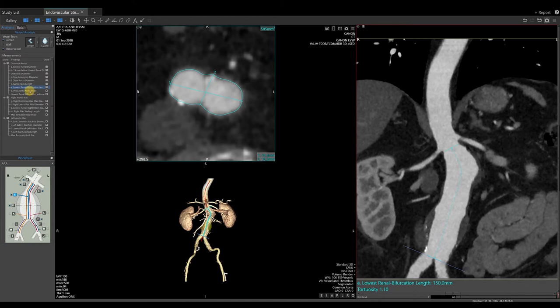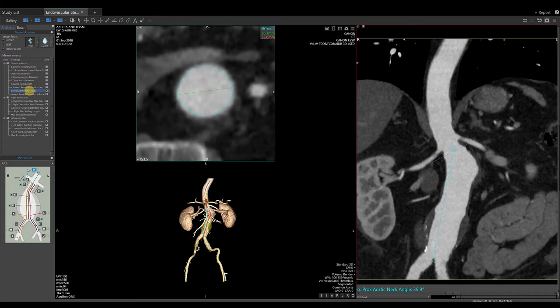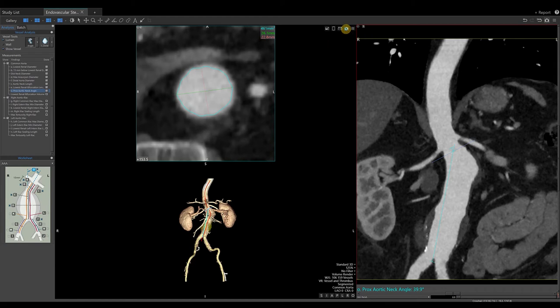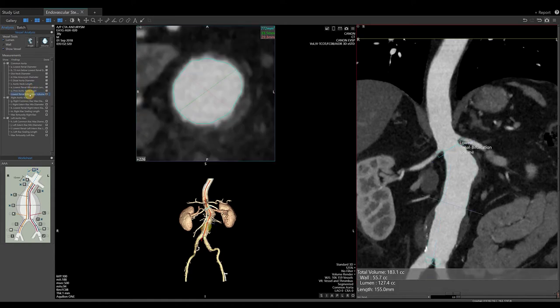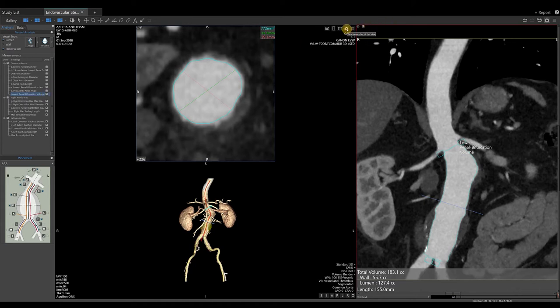Select the next measurement, proximal aortic neck angle. Again, the software will automatically create this measurement for you. Notice at the bottom of the CPR image the number of degrees of this neck angle. If we agree, lock the measurement in place and take your snapshot. Select the last measurement in the common aorta, lowest renal bifurcation volume. Software will automatically place this measurement. Notice at the bottom of the CPR image we have a total volume in CCs, a wall and lumen volume, along with a length measurement. If you agree, lock in place by checking the box on the measurement list and take a snapshot.